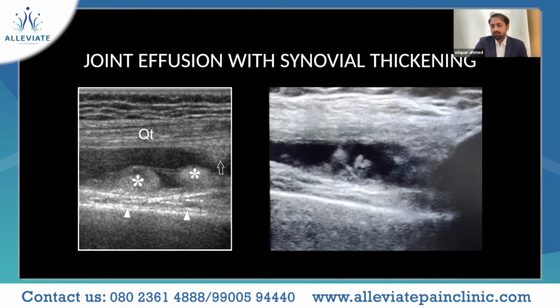And in these cases, one more thing which you can notice is that there's probably a lot of fluid, and Dr. Javed will be discussing the intervention part, but I thought I'll just mention it. You try to tap it out, but you may not be able to aspirate a lot. It will look as though there is a lot of fluid present. And with the synovial thickening, when you give pressure with the probe, you can see it. One more thing you can do when assessing this area is give pressure from down, so you can see the distension and the movement of the synovium inside.